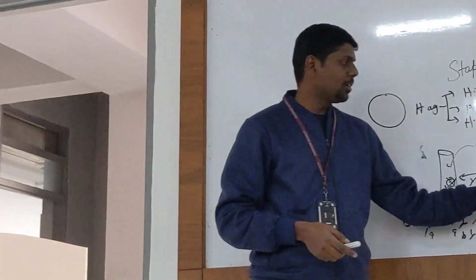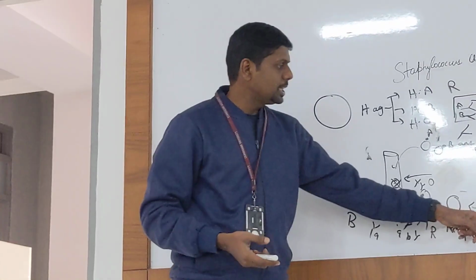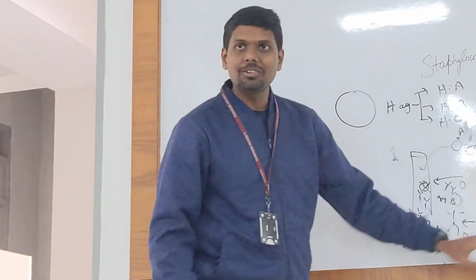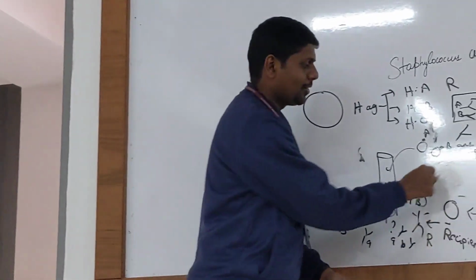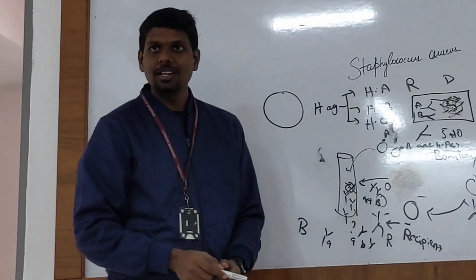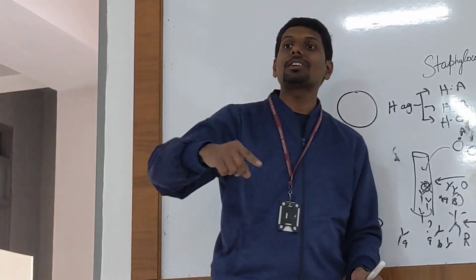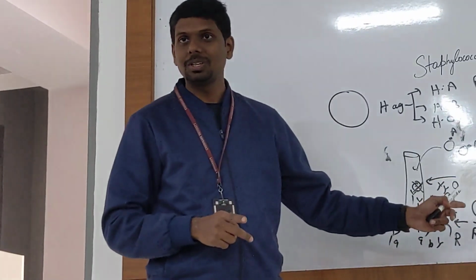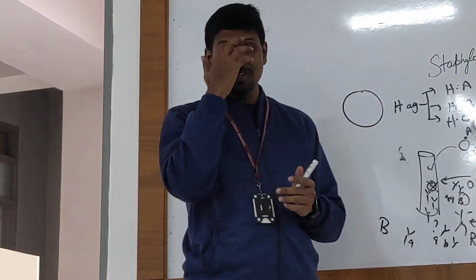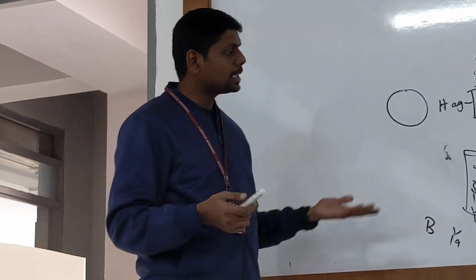And these people are 1 in 10,000 of the population. Identifying these patients is very tough. Why is this very tough? Because if you do normal blood grouping on their blood sample, we will assume they are O negative individuals. Yes, sir. And very rarely will they go for transfusion. Only then will we go for cross-matching to identify this issue. And usually we will miss them. We will lose them because of the asymptomatic condition.